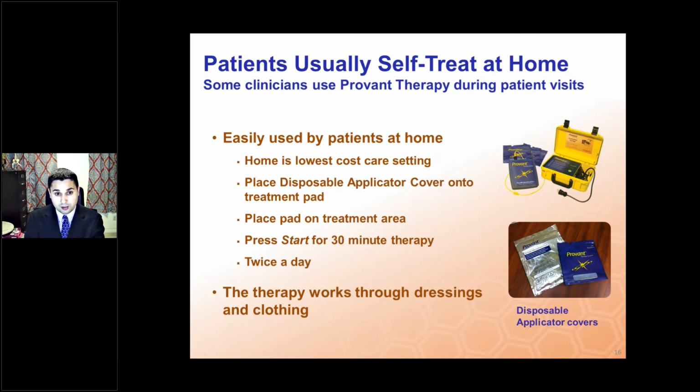And it can be applied through dressings and clothing, although if there's no wound infection or any reason you can't set it directly over the site, you would probably rather do that than go over clothing, because again, it puts the device closer to the source of pain, because depth does make a difference.